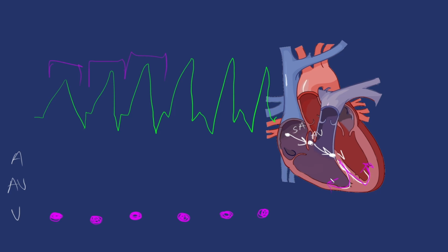So this is one of those times we'd have to really get a 12 lead EKG to figure out what's going on. If we're just looking at this with one lead, you can't necessarily say if this came from the AV node or not, because as we talked about, the left bundle branch block or right bundle branch block before, or if they have a paced rhythm or anything like that, that could make a wide QRS. But for the sake of this, it gets treated the same no matter what. We see a wide QRS, and the assumption is it didn't come from the AV node.